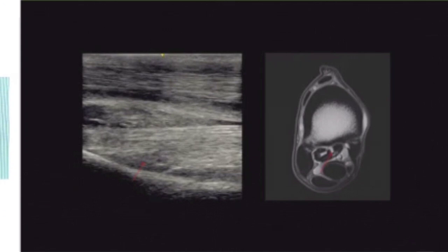You might be hitting an area of fat and muscle bundle. So for example, when you see a hypoechoic area in long axis, you cannot immediately jump to that being a lesion at the origin of the suspensory. You have to go back, compare it to your transverse, and make sure that you're not just getting a portion in between the two bundles.